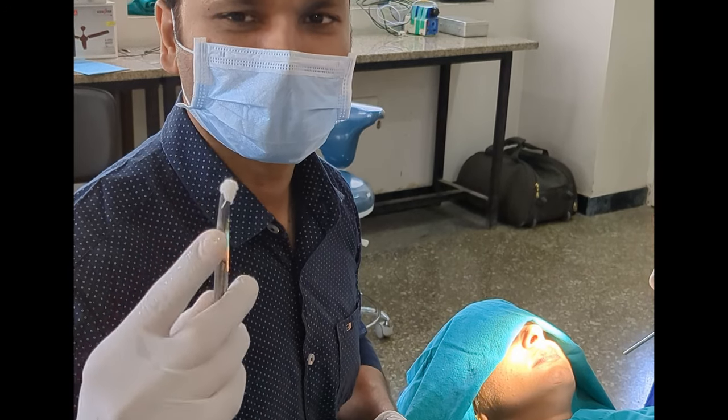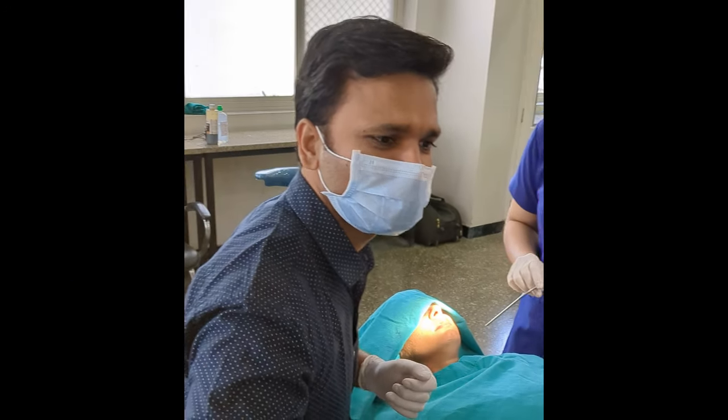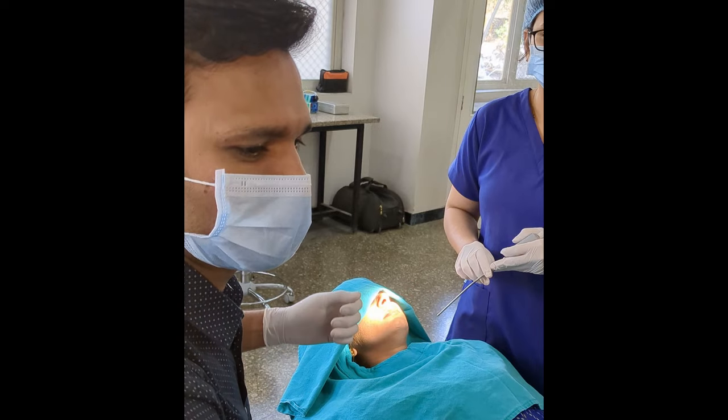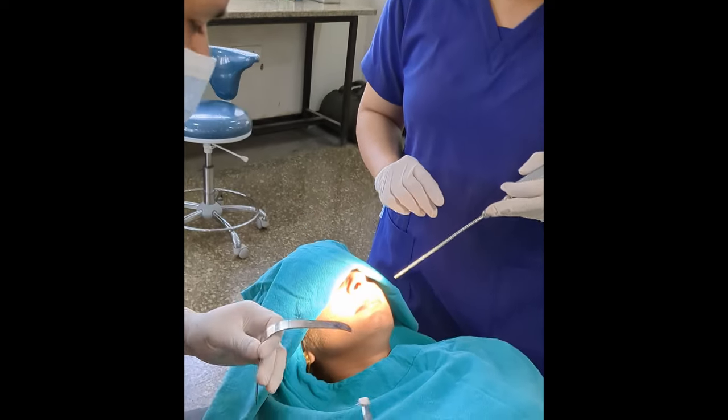This is a topical anesthetic soaked gauze which I am going to use to apply topical anesthetic at the site where I am going to give local anesthesia.